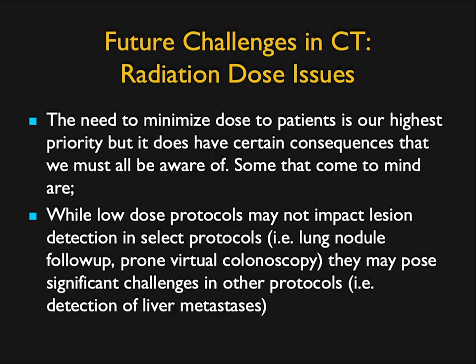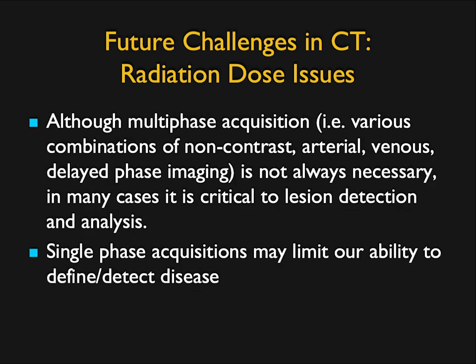Now, of course, we have challenges. I mentioned phases before. This is not just thyroid. This is kidney, liver, adrenal. The more phases you have on studies, the more likely you are to be specific and recognize what's an incidentaloma and what's a real lesion. As we try to decrease dose to patients and we limit phases, this can be somewhat of a challenge. Also, in terms of following patients up, you want to make certain you do the right phases and only the right phases. When you're doing routine follow-up, perhaps you need fewer phases, but you need to make certain you get the information you need.